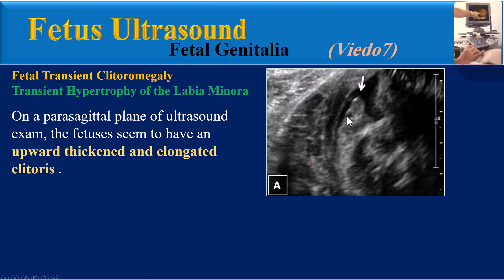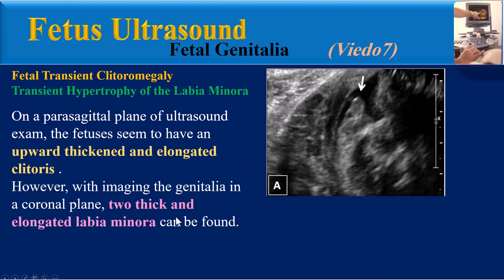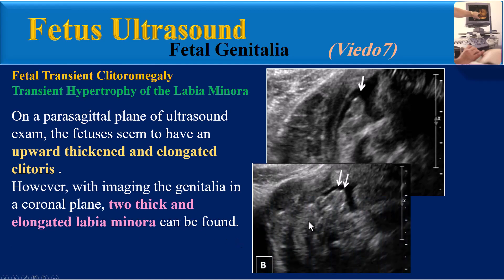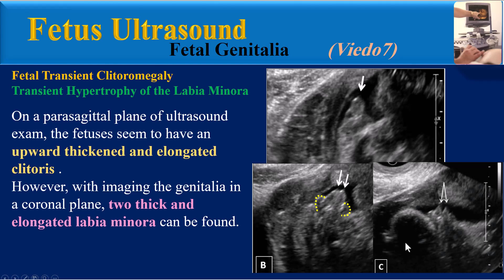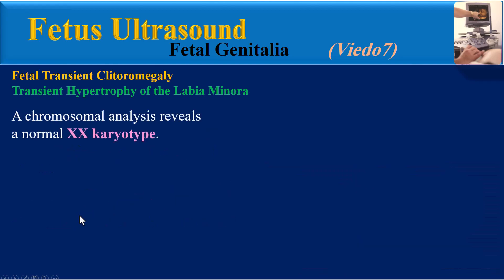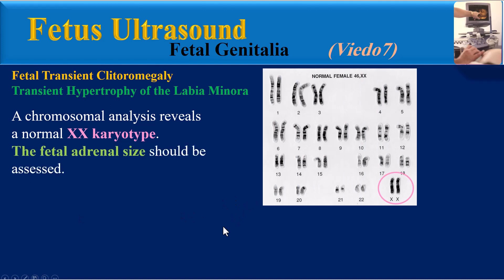On a parasagittal plane of ultrasound exam, the fetuses seem to have an upward, thickened, and elongated clitoris, as we can see in this ultrasound image. In a parasagittal plane at 22 weeks, we can see upwardly directed clitoromegaly. However, with imaging the genitalia in a coronal plane, two thick and elongated labia minora can be found. This coronal plane from the same fetus at 22 weeks shows two thick and adjacent labia minora which extend beyond the labia majora. Another image from the same fetus in a coronal plane shows the two labia are separated.